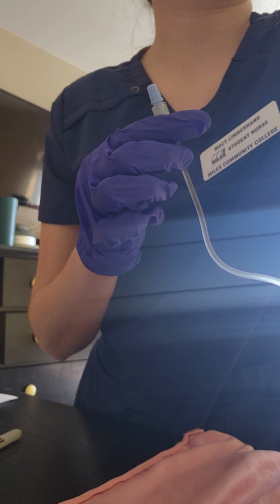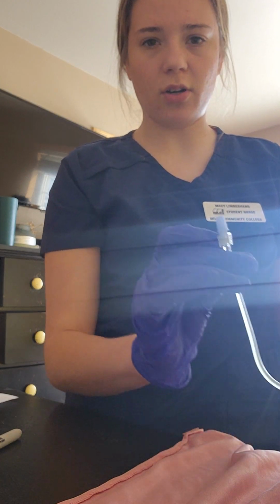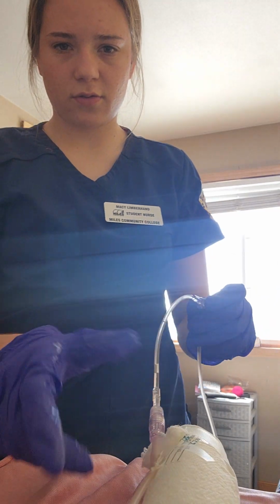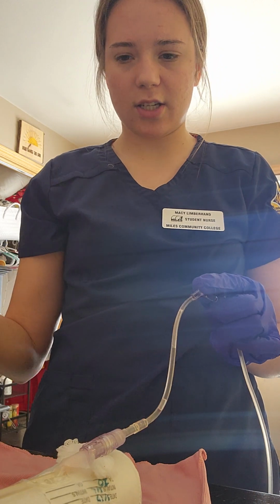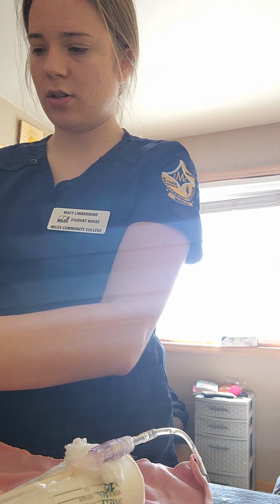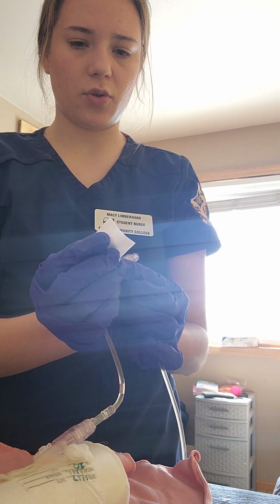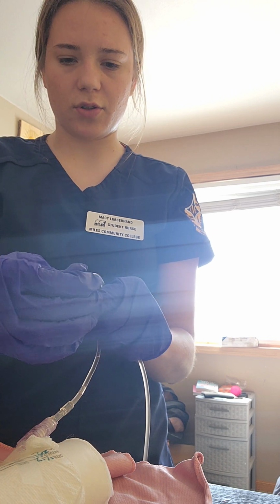Okay, so I'm going to hang it above my primary, and then I have my patient here, her IV. See if I can show you better. Okay, so this is her IV, and I would have inspected this and made sure that there were no signs of phlebitis or irritation. So then I'm going to come to this little port here, and I'm going to wipe it off with an alcohol swab.